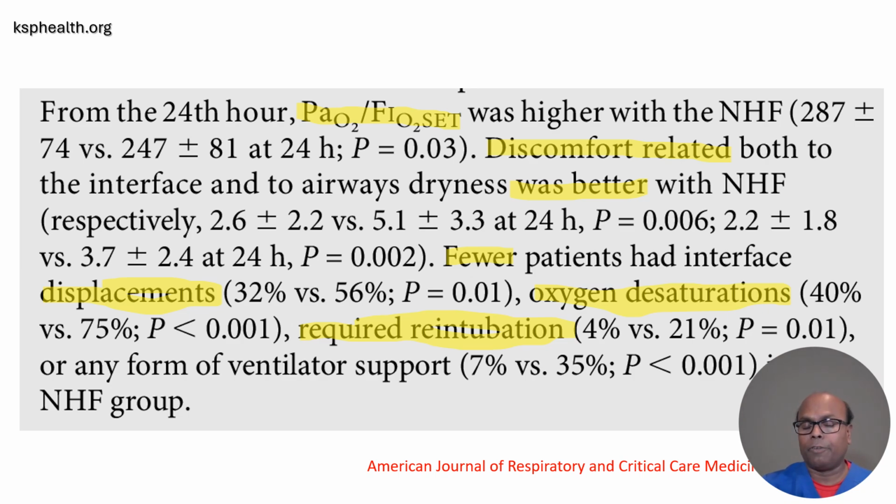Fewer patients had interface displacements because there is none. And oxygen desaturations are lower with high flow nasal cannula oxygen, and they require less reintubation than the conventional face mask oxygenation. All of them are statistically significant, as you can see.